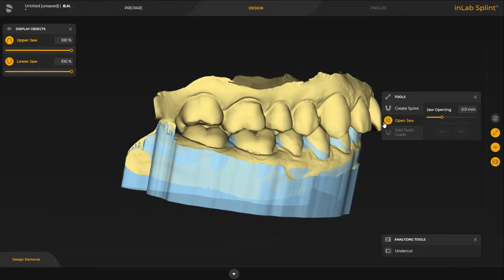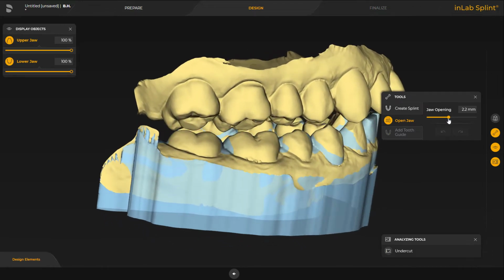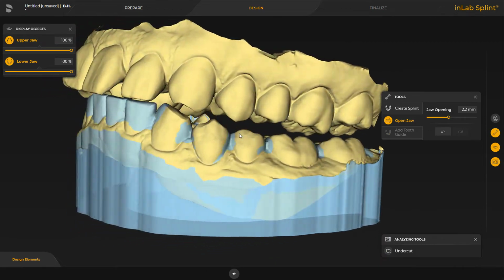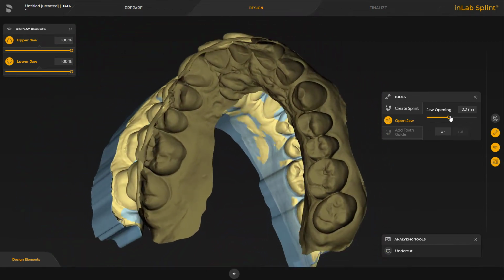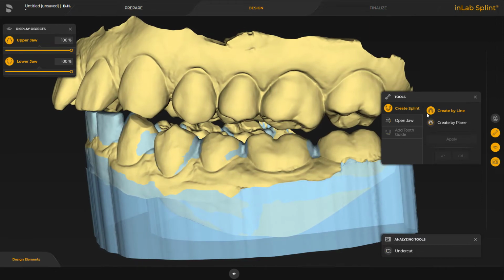Next step would be opening the jaw. So we're going to increase the bite, and I usually try to do that looking from the buccal side so the cusps are not touching, and this is a good reference point to see how much you need to increase, and of course this depends on the patient. We now create our splint.